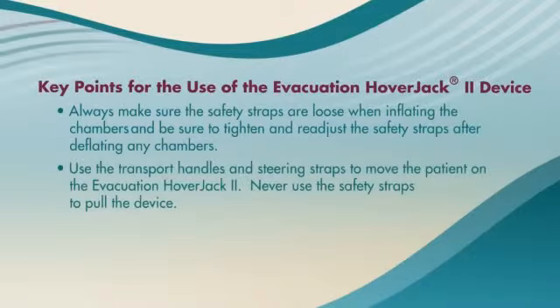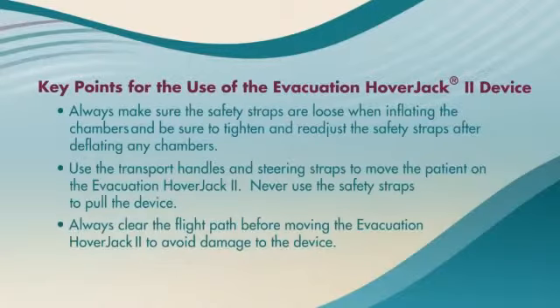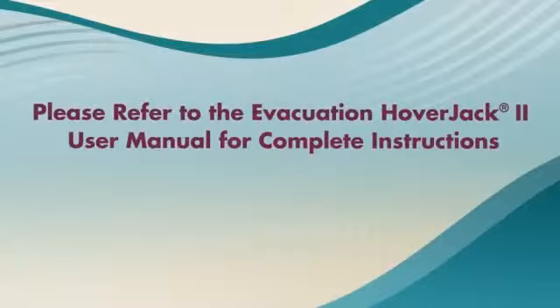Use the transport handles and steering straps to move the patient on the Evacuation HoverJack 2. Never use the safety straps to pull the device. Always clear the flight path before moving the Evacuation HoverJack 2 to avoid damage to the device. Please refer to the Evacuation HoverJack 2 manual for complete instructions.